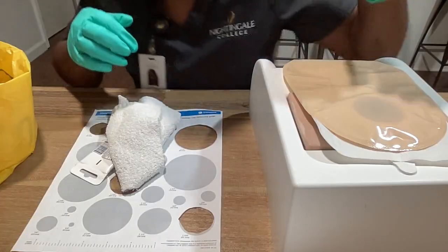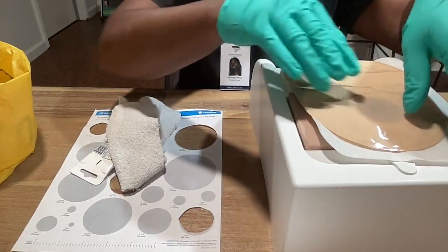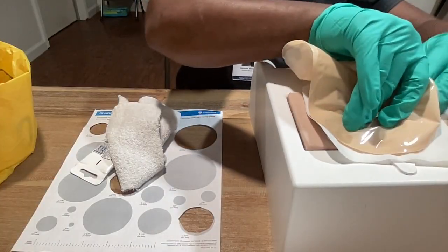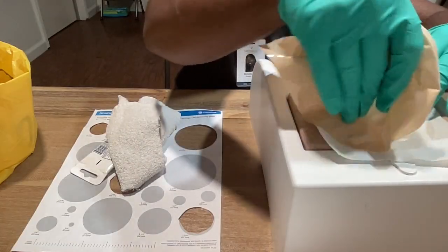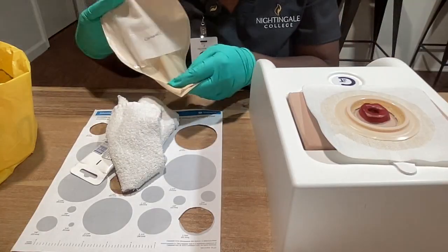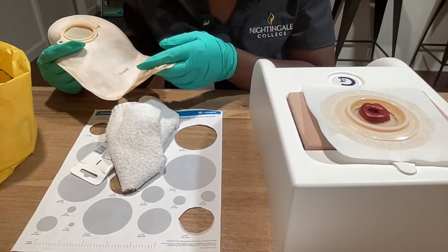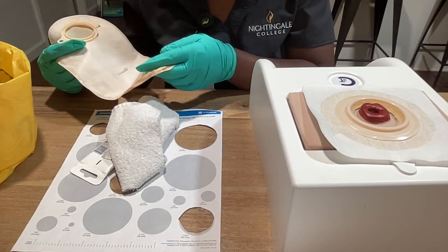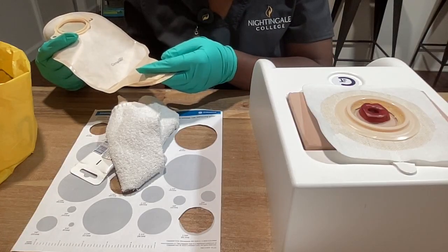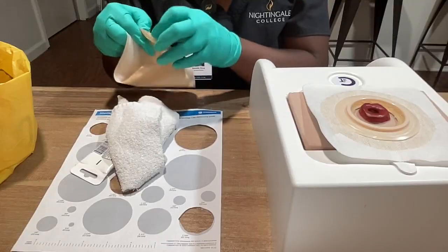Ms. Jones, I will begin by removing the current bag that's on you. When removing the bag, you just unclamp it and then discard of the waste. You would dispose of it in a toilet or another approved location. If the stools are liquid and if indicated by the doctor, you would measure it, and then you would dispose of the bag.